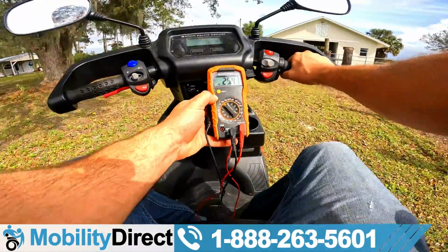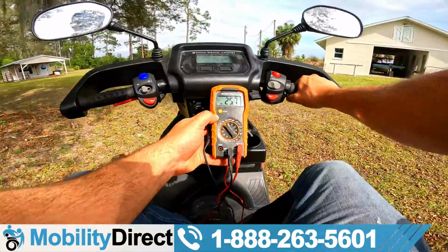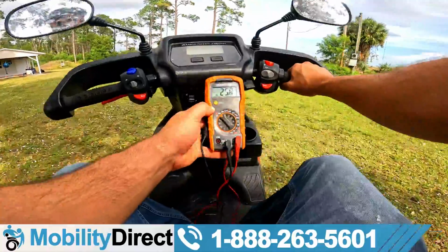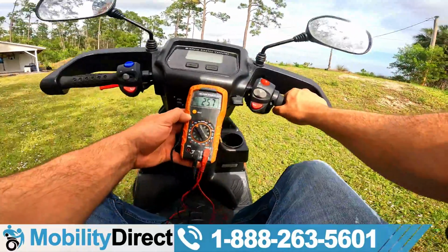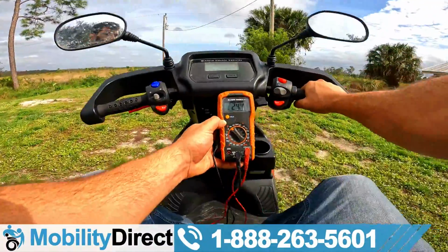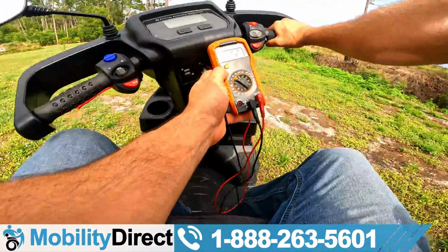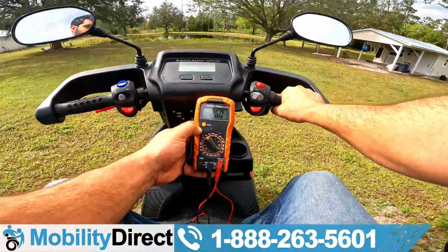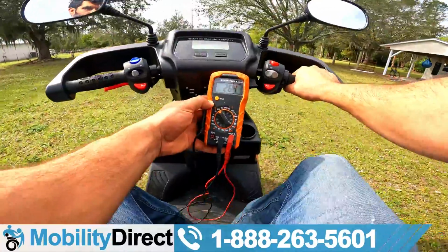So I'm gonna go for a little while longer, go up this hill, keeping an eye on the voltage. We're at 25.8, 25.7, 25.6. Let's see what happens when I go up this hill. 24.2, you saw that? So it actually went down to about 24.2 when going up the hill. That is a little concerning.